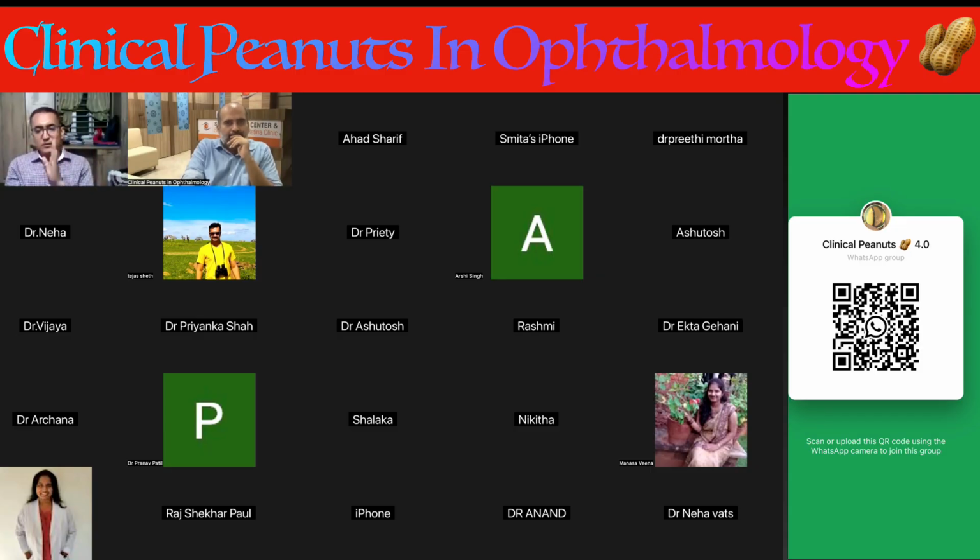But if the patient is coming to you after 2 weeks and some sort of regression is in your consideration, then it's better to look at the refraction, put in all the data, and of course you can see the previous chart also, what was there, and with the newer suggestion, you can apply your own calculation of where I should do and what I should do.